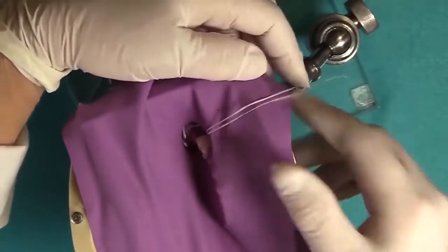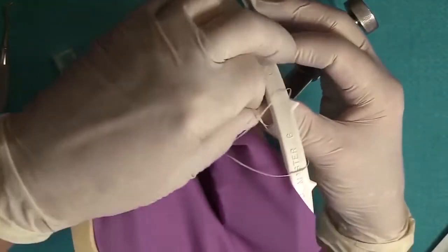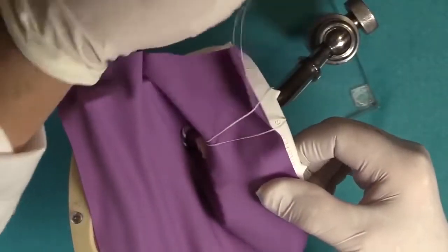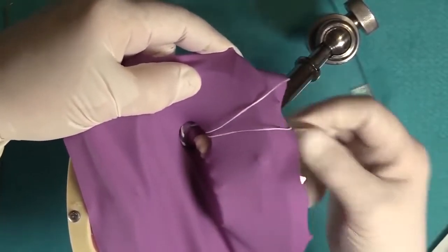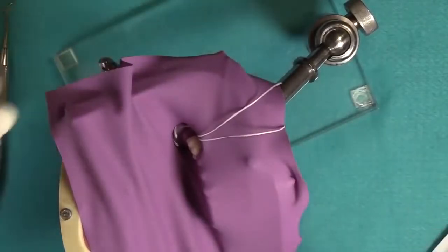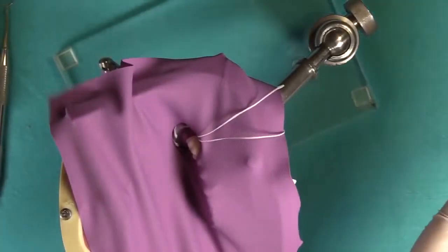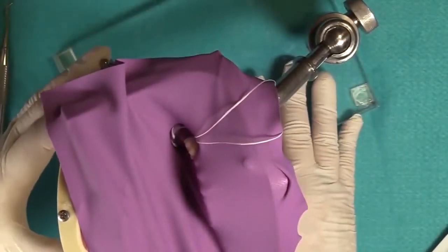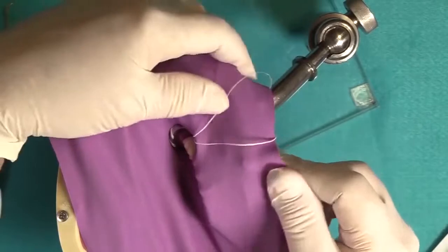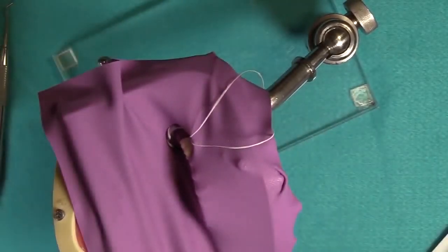Now another thing you can do with this floss, for example, with this frame, you can just simply wrap it, release a corner and then wrap it around this way and then reattach the prongs. Now what that does is that if for some reason the clamp should pop off, it's not going to go across the room. Any of these things that are under spring tension, if they come off pretty aggressively. They do. I've seen them fly across the room.